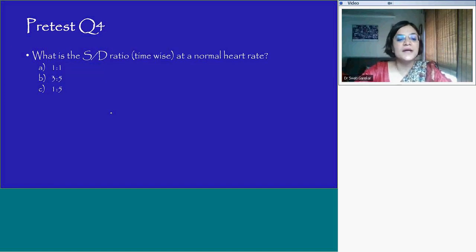Next is, what is the systolic diastolic ratio time-wise at a normal heart rate of 75? So is it 1:1? Is it 3:5? Is it 1:5? What are your thoughts on that? 1:1, I'm happy people are applying. Somebody says 3:5. Somebody says 1:5. So again, 33%. All right.